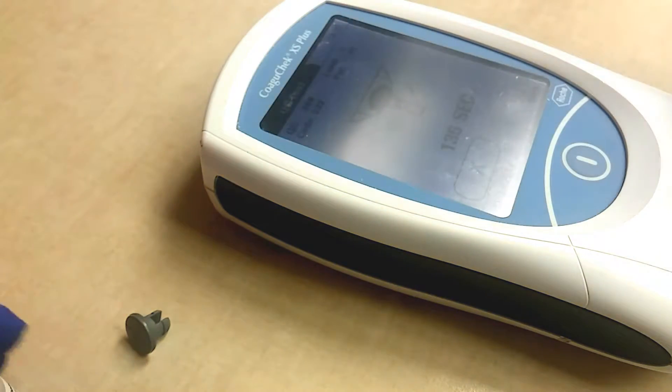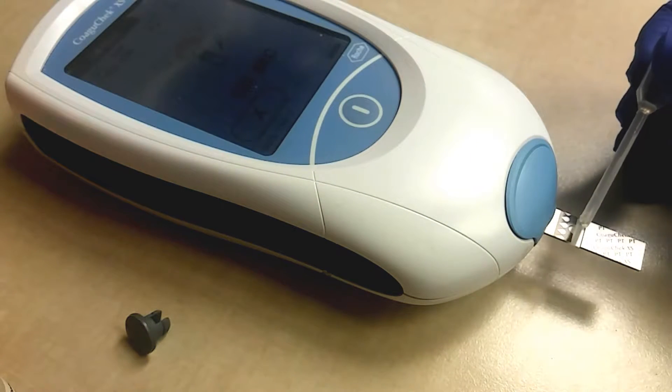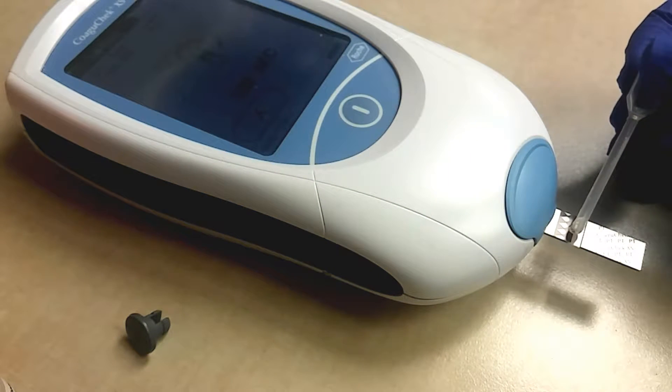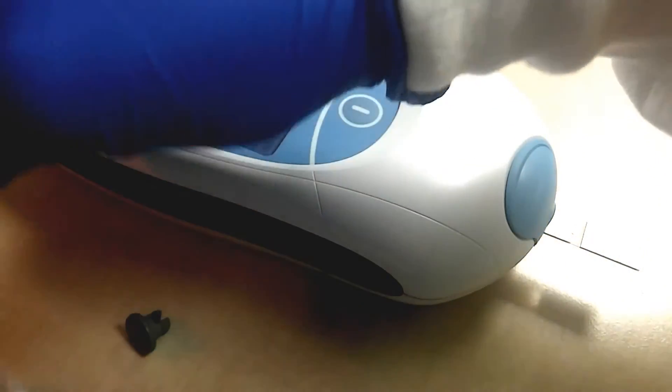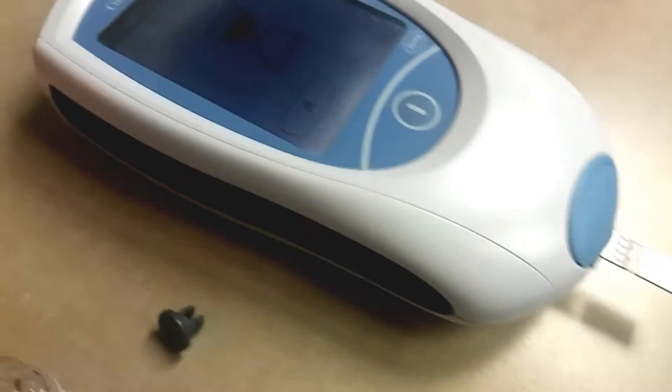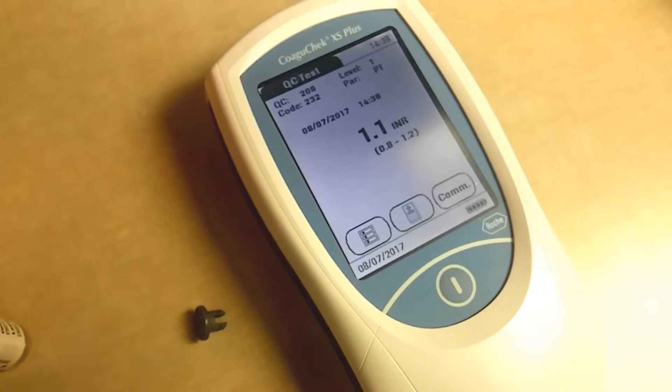Go ahead and add it right here where the little drop marks are in between there. Then you can see on the screen the pipette screen came up, and you got a 1.1, which is within the QC range of 0.8 to 1.2.